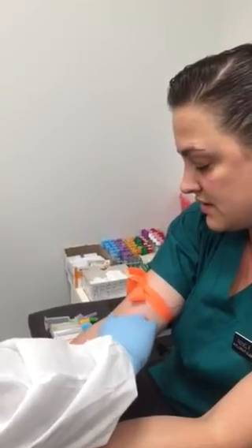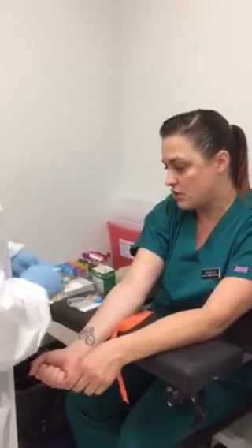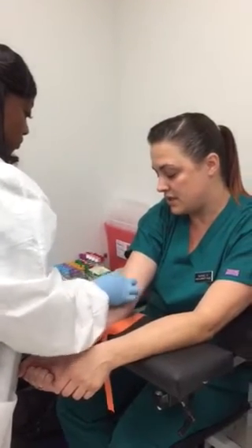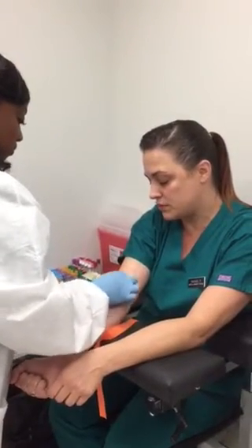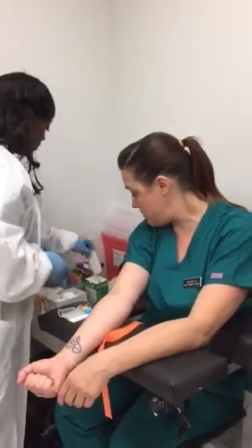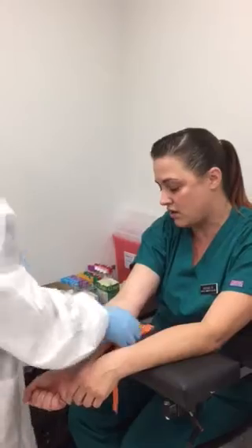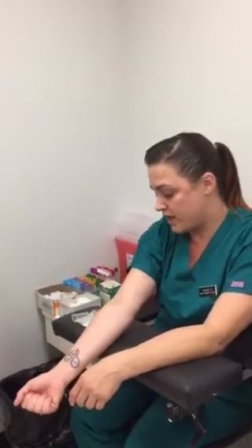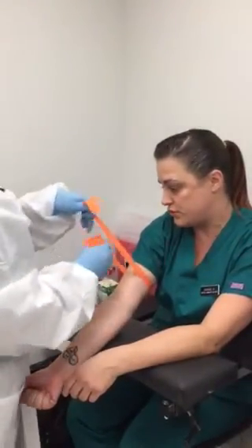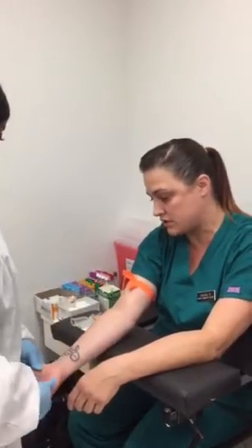Once she finds the site, she's going to release the tourniquet and clean the site with isopropyl alcohol in a circular motion, then discard the pad. Make sure you wait at least 30 seconds for the alcohol to dry so that you do not hurt the patient because it can burn, and so that it does not affect the testing results.